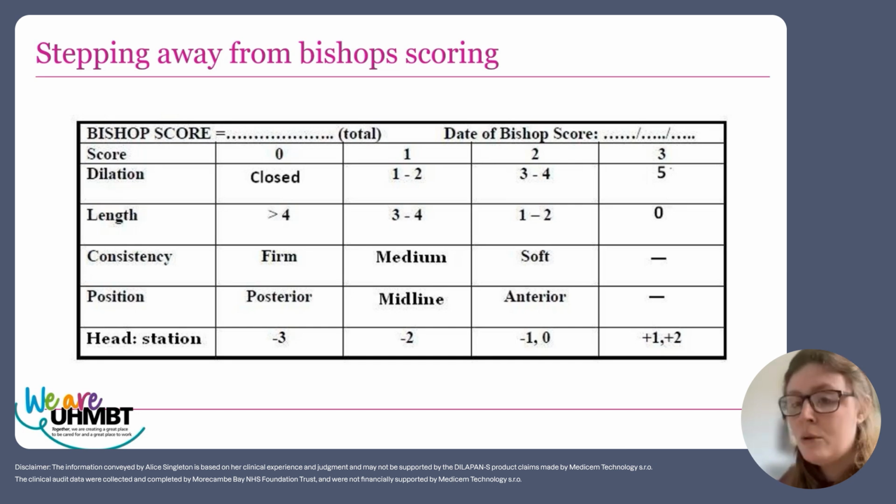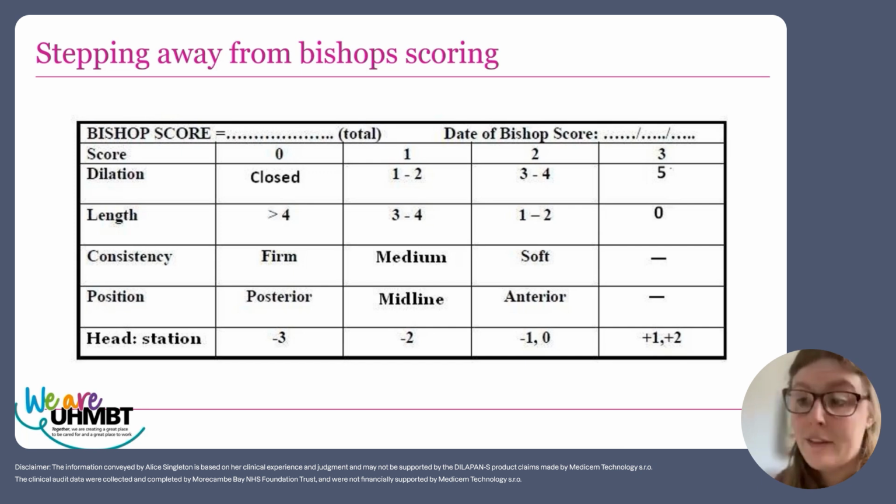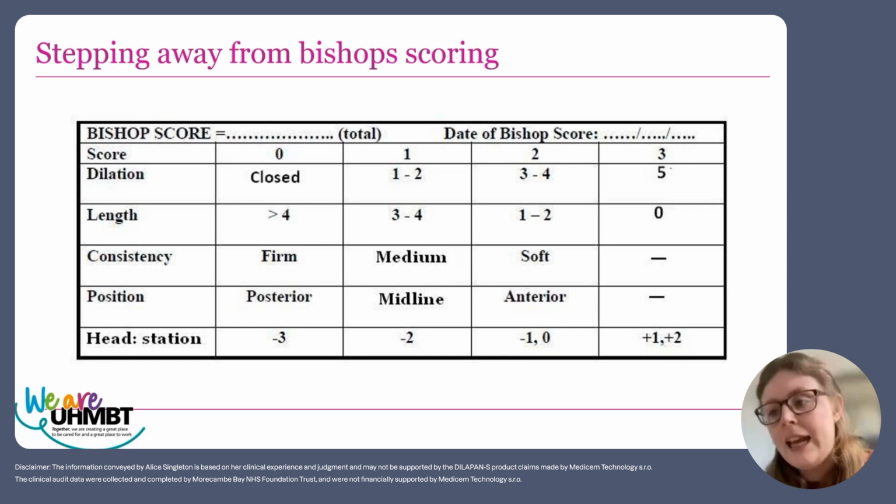So let's talk about Bishop scoring. It used to confuse me when I was a student, and then I felt like I finally got it, and now we're on Dilapan, and I'm like, it doesn't work with Dilapan. Most of you should be familiar with Bishop scoring. Either you have used it or you currently use it. It's quite old now, and basically we're scoring the cervix as to how favourable it is for ARM, or for labour, if we're thinking about it in that sense.